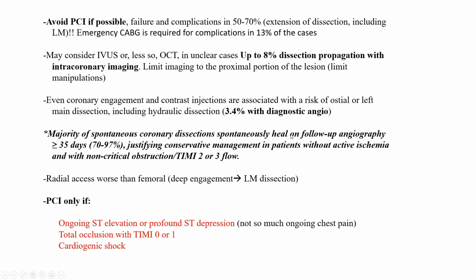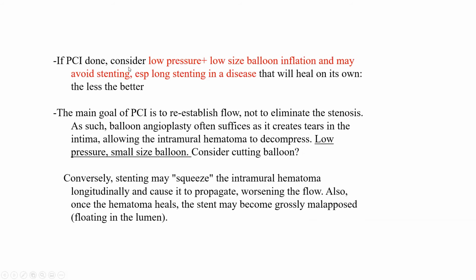Now, I will give you some tips here. Okay, if you need to do PCI in those patients, what are the PCI tips? So one, the PCI goal is not to make it look nice. It is not to eliminate the stenosis and make it 0%. The PCI goal is to establish flow. It's okay to be left with 99% stenosis if you have TIMI 2 to 3 flow and no ST elevation.